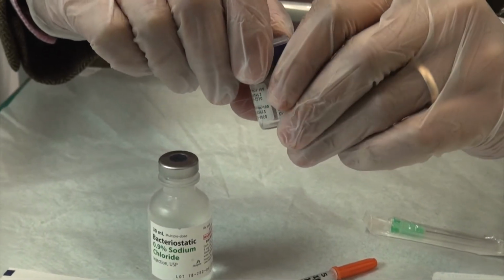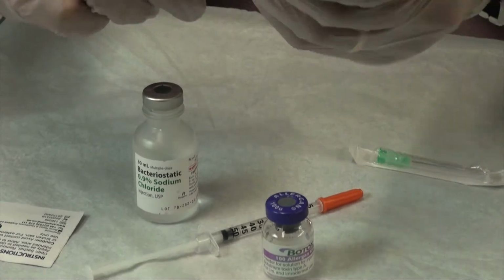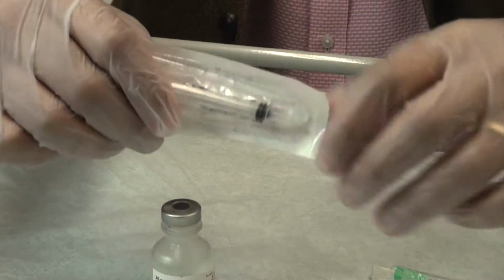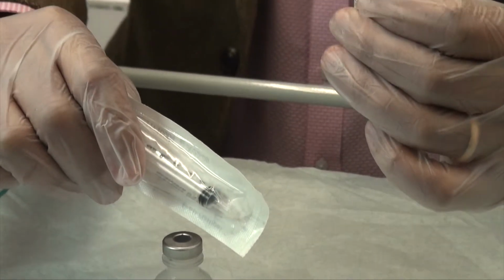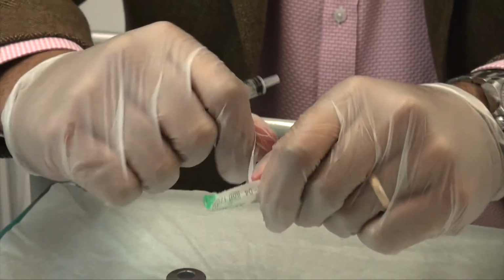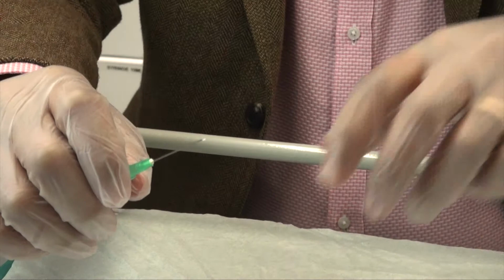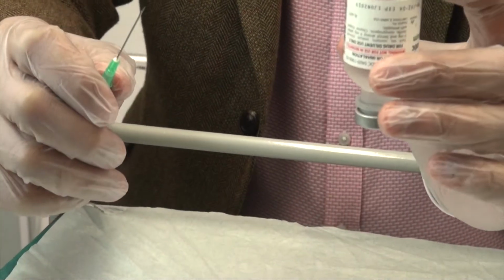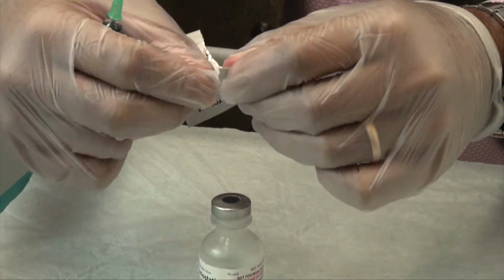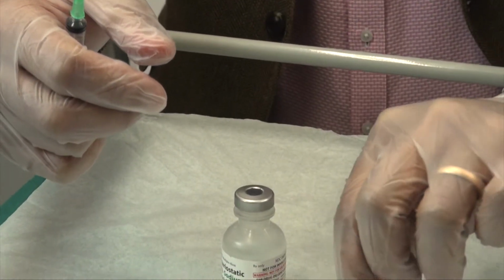We're going to remove the top of the glass bottle, and I use a 2.5 ml syringe and a 21 gauge green needle. With this, I shall withdraw 2.5 mils of bacteriostatic saline from the bacteriostatic saline vial, and also we use an isopropyl alcohol wipe to swab the tops of both vials.